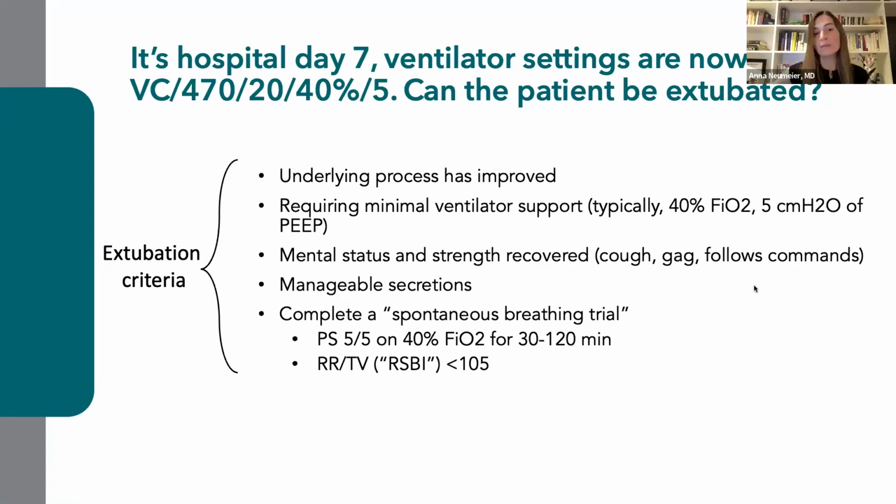And then finally, we have them complete a spontaneous breathing trial, where they breathe spontaneously on pressure support settings that are minimal, inspiratory pressure of 5 over a PEEP of 5, on minimal oxygen for roughly a half hour to 2 hours. And if they're able to maintain relatively high tidal volumes and low respiratory rates, that can meet criteria for extubation.